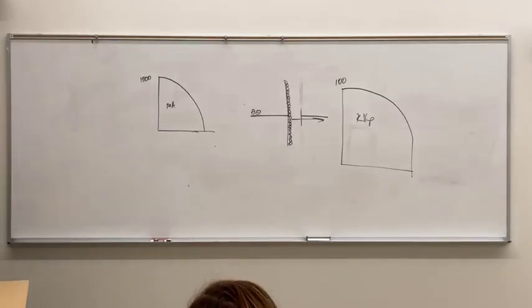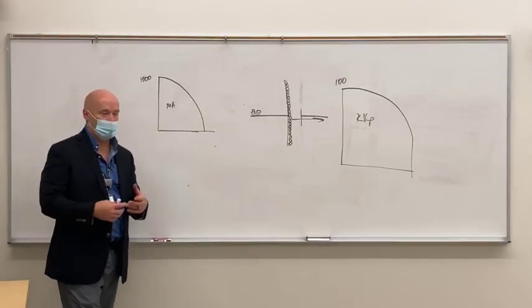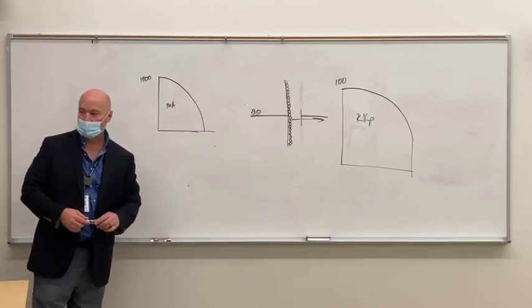So current times potential. And how they calculate the rating for a high voltage generator is a maximum tube current at 100 kVp and 100 milliseconds. So any generator that you work with is always going to have a power rating. That's how they calculate it.